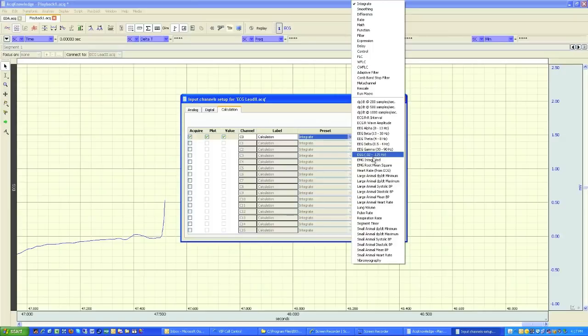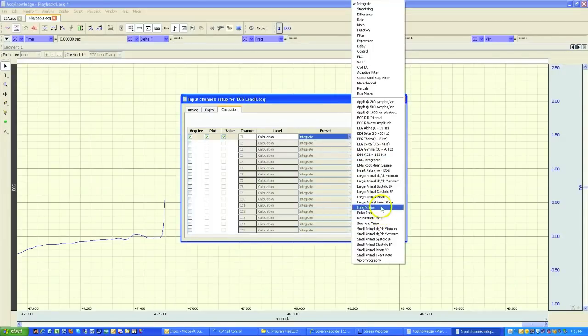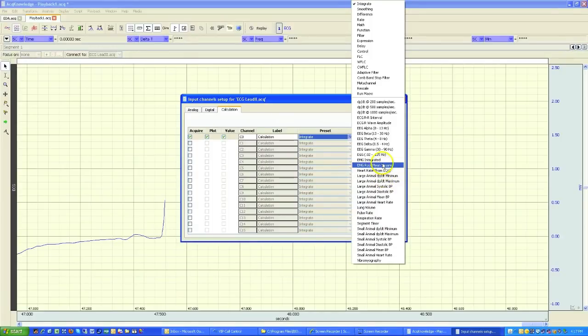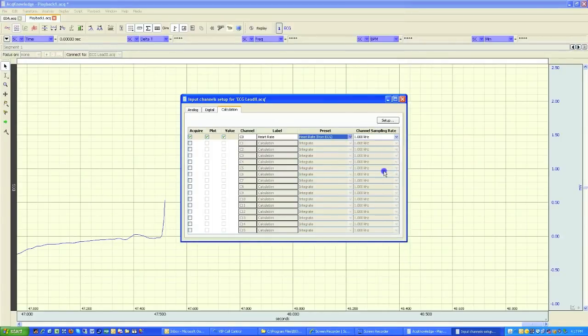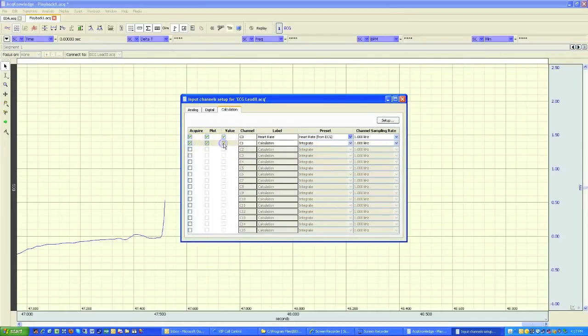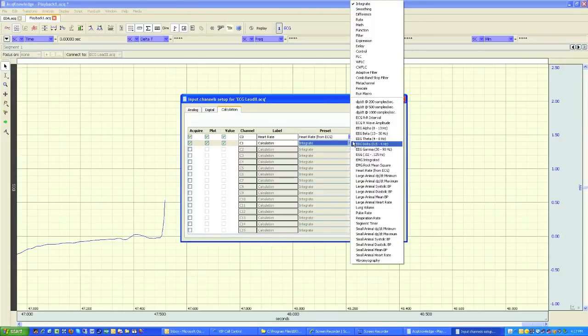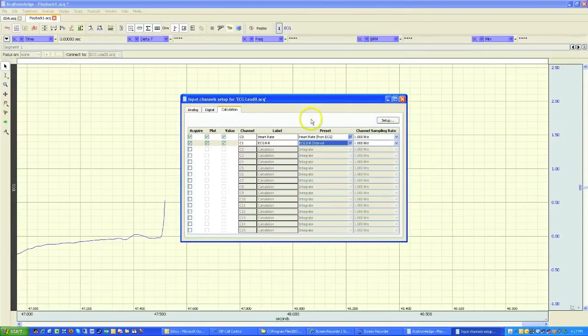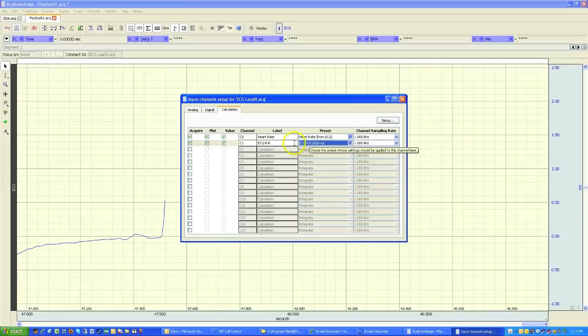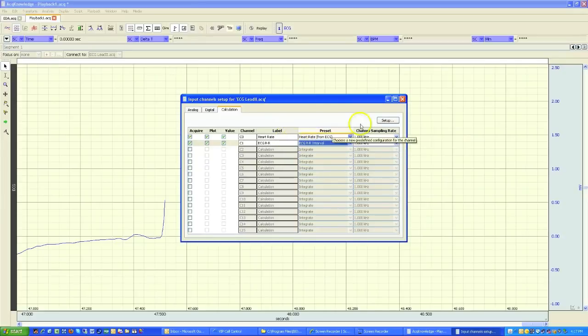And somewhere down here I've got heart rate from ECG. And I'll also add R to R interval. So we'll get two tachograms. One for the R to R interval and the other one for heart rate.